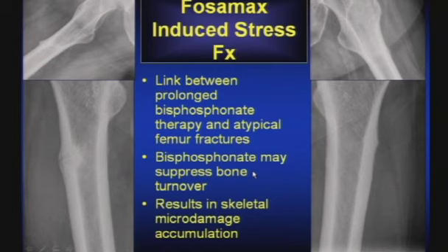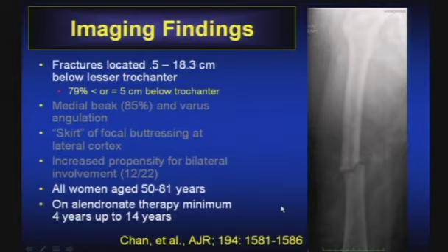They're called stress fractures in the literature, and I really think they probably are more likely an insufficiency fracture, right? Because this is abnormal bone that's being laid down, and that's what's failing. So I really like this article that was produced in the literature by Dr. Chan from, I think he's from NYU. Kathy Perchprava is in the audience here. I think this came from their practice at NYU. So this is a really nice article, and it summarizes a lot of the findings.